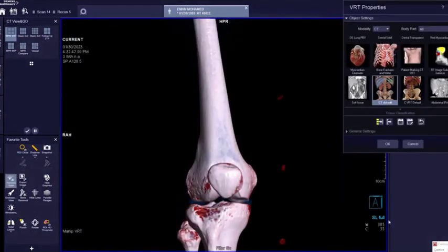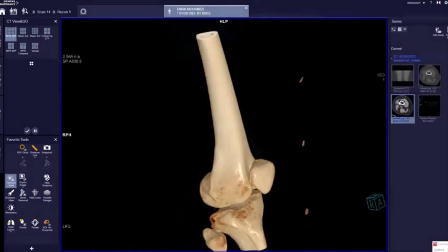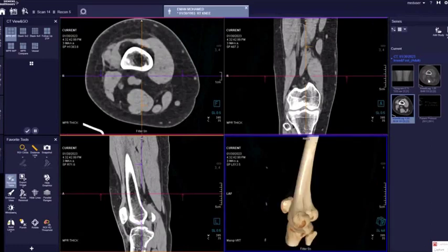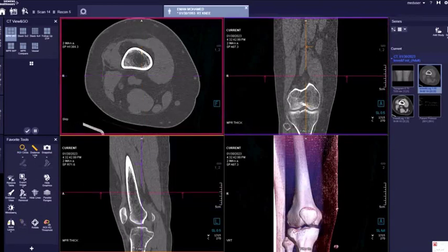If I move the table and choose a lot of gallery for the 3D, this is the 3D shape, very excellent for the knee. After that, I want to cut the image for axial, coronal and sagittal and see how I can print these cuts for the film.